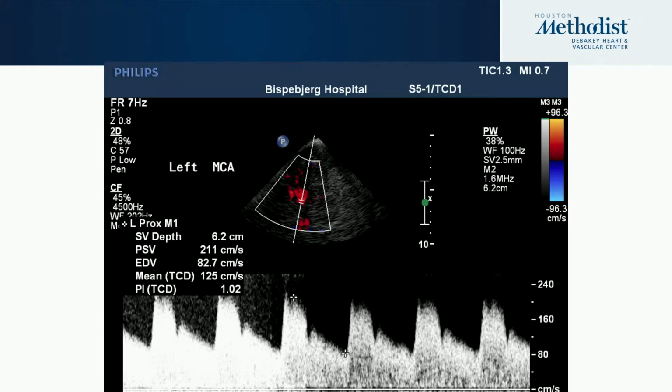Purposely, we are injecting a contrast agent when we would like to see the middle cerebral artery better on our TCD. This is why I had to visit my friends in Denmark because, again, the indication for the intracranial circulation is not there yet. So I hope that the companies will go into reach indication not just for the liver and heart, but hopefully for the brain. So that's the better visualization. If I wouldn't have this contrast, I wouldn't be able to see the stenosis.